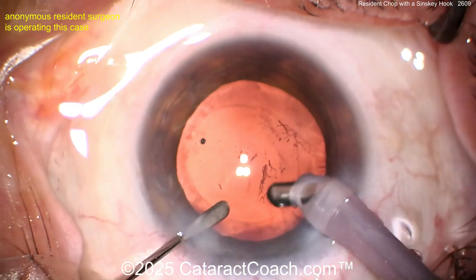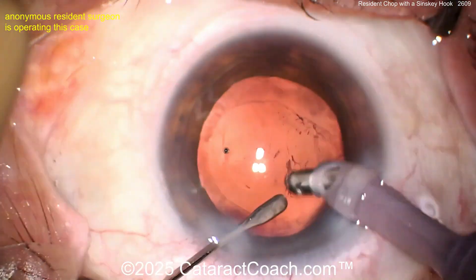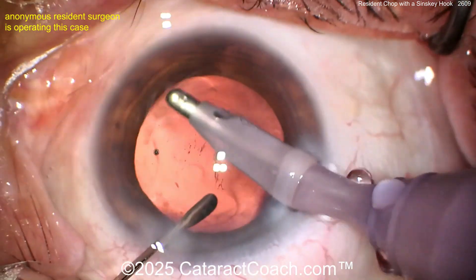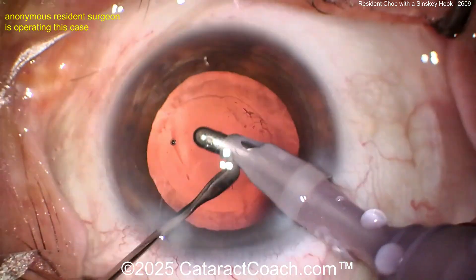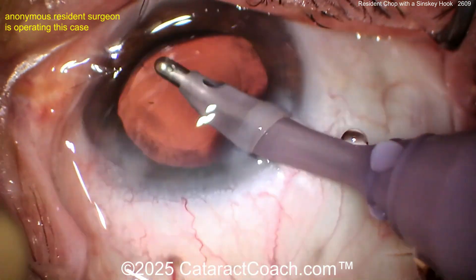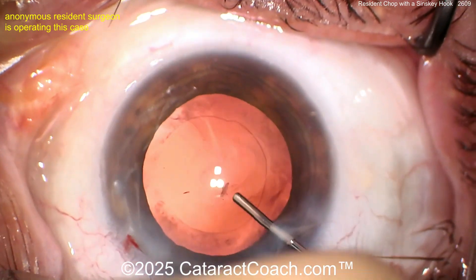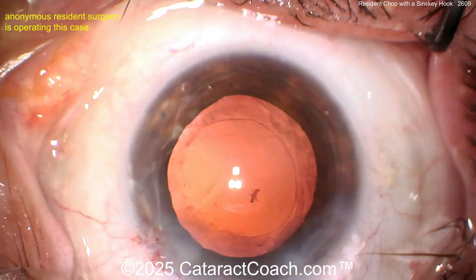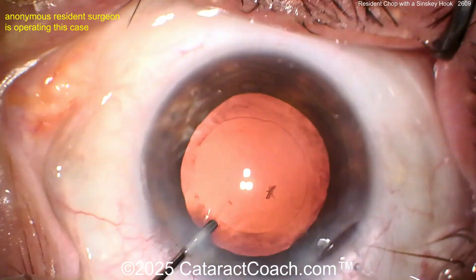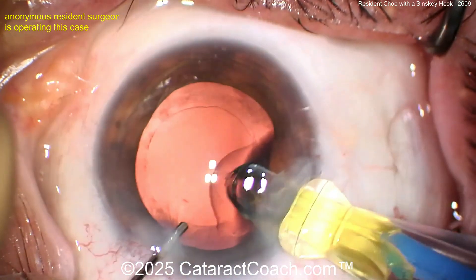This is an anonymous resident — I don't know exactly how many cases you've done, but I'm guessing 100 to 200 cataracts, and you've obviously got great skills. Keep up the strong work; I like your technique. My big advice: your incision is a little short and I don't like your draping, but other than that, really fantastic. This is better than my case number 150 — you're doing great.